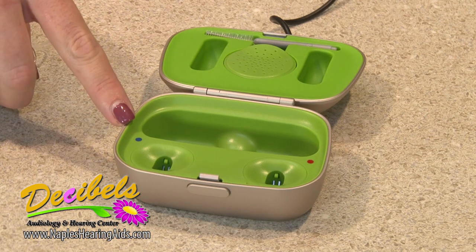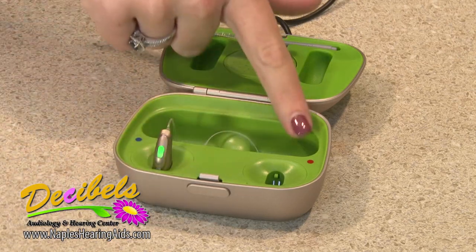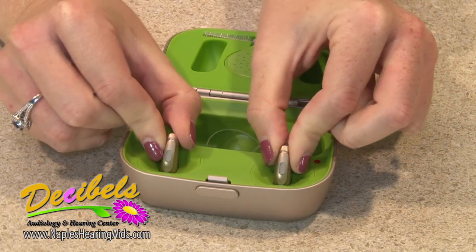Open the case and place the left device next to the blue dot and the right device next to the red dot. Press down firmly on the devices so that they are secure in the case.